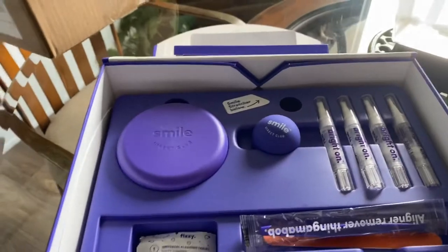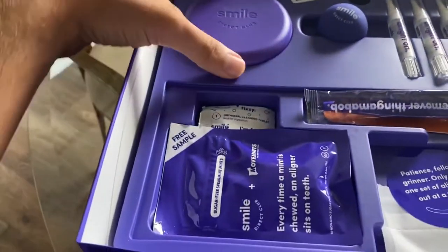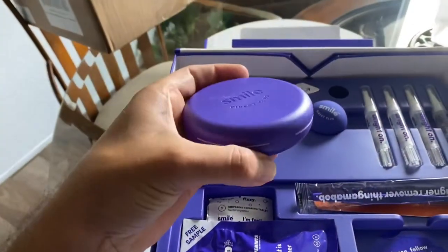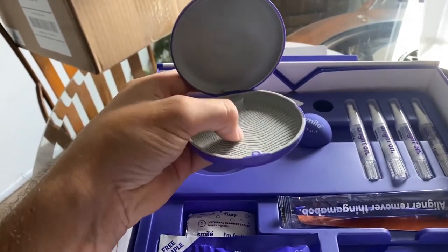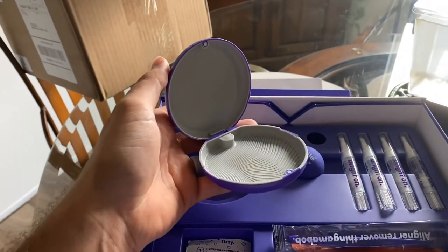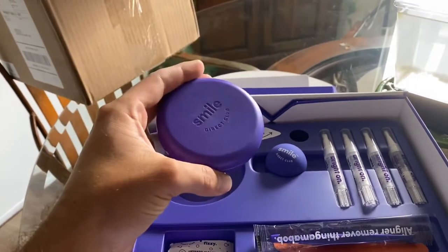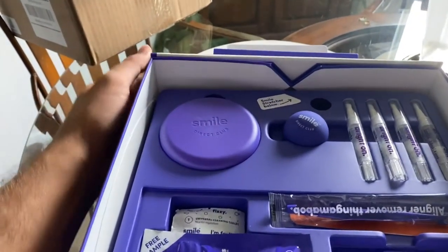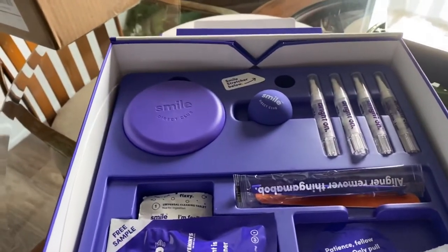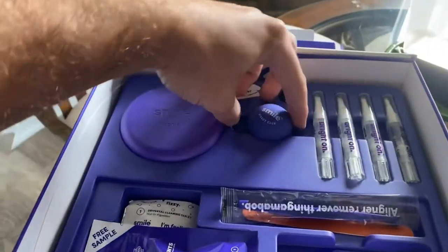Once this is emptied we have a couple of things to look at. Number one is our retainer box — it's padded on the inside with some grip so it doesn't slide around. This is for whenever you are going out to eat — not for going to bed, but for small portions of time that you take it out — it'll keep it protected and not have it wrapped up grossly in a napkin.